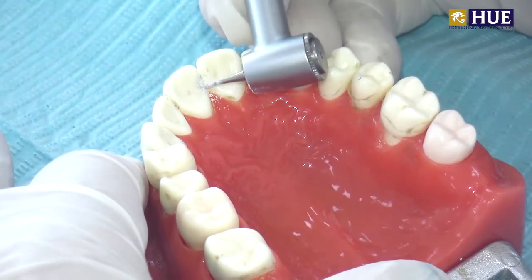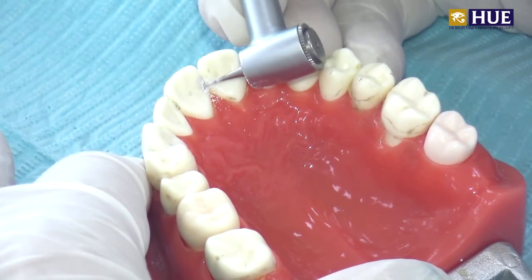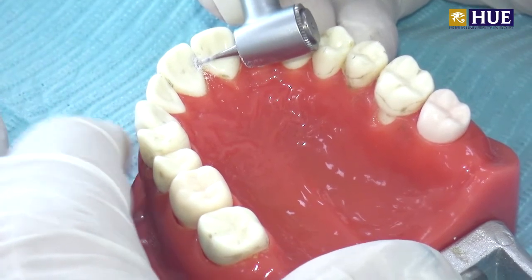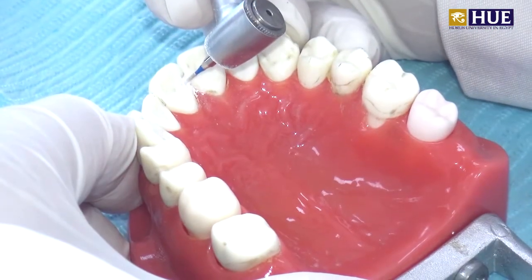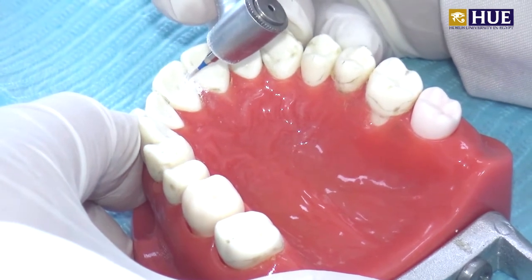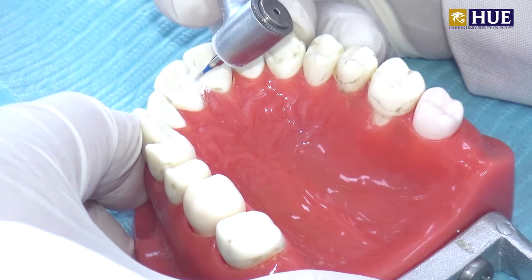As I mentioned before, your cutting should be intermittent, not continuous. With every cut you have to check the depth, the outline and so on. Enlarge the cavity with the same bur, or change to another one, for example an inverted cone bur or a fissure bur.